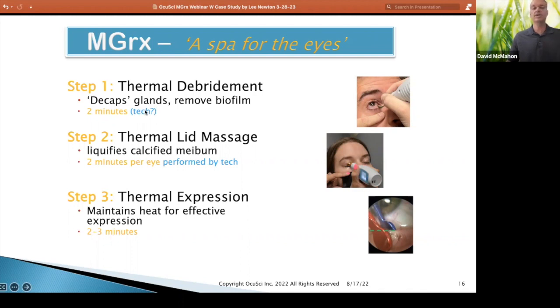It's up to you whether you'd have your tech do this, or maybe the laws of your state. The thermal lid massage — definitely have your tech do this. It's two minutes per eye using ultrasound gel, applying heat and light pressure. You're all familiar with that idea, and this is all using heat and light pressure to get ready for thermal expression.